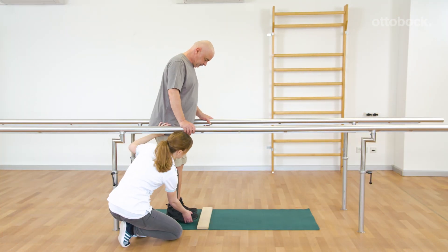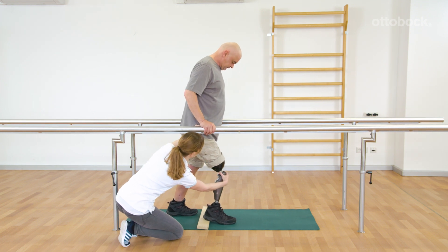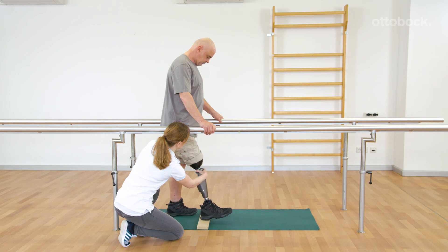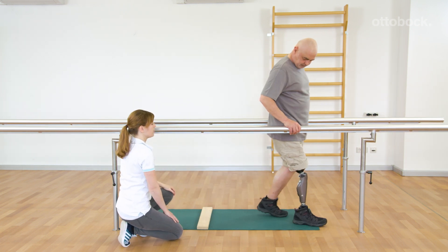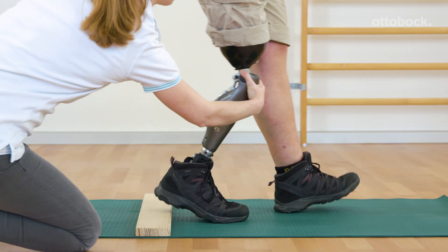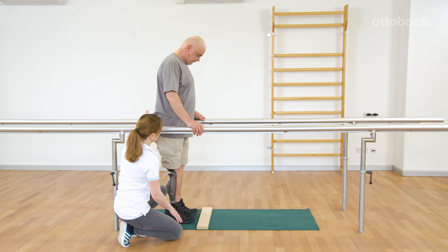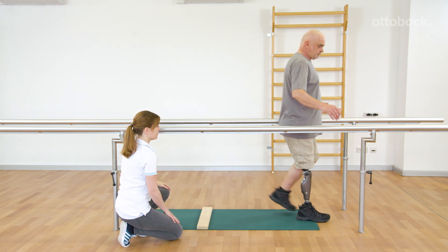Gerhard learns a yielding step. He uses the stance flexion resistance to cross a small obstacle. Franziska supports the knee flexion and accurate timing right at the knee joint. Gerhard should allow the knee flexion when the contralateral leg takes a step forward. The exercise should be done without holding onto the bars as soon as Gerhard feels secure.